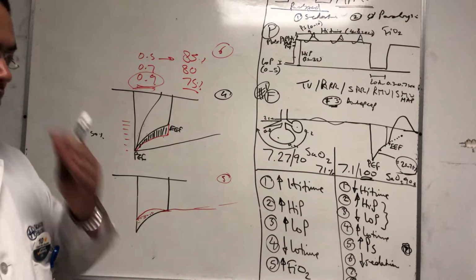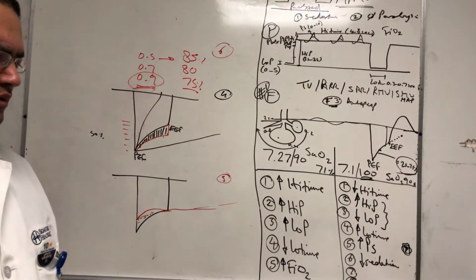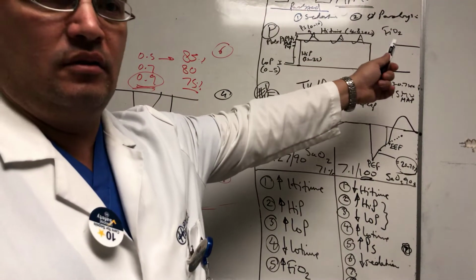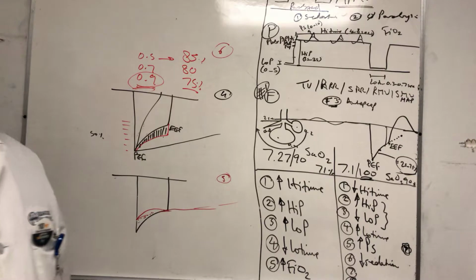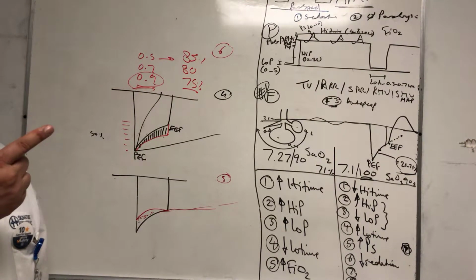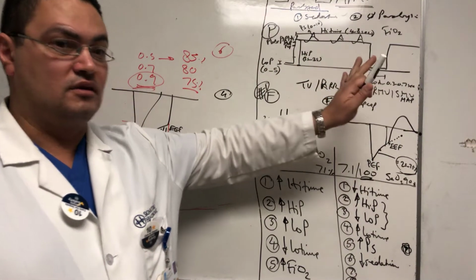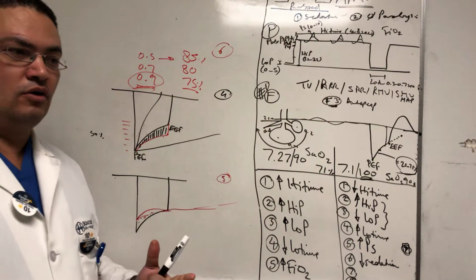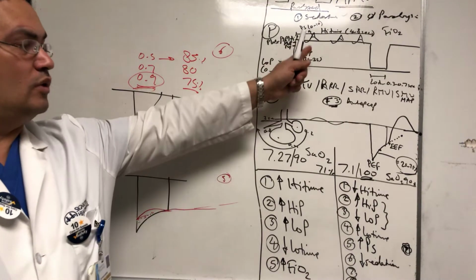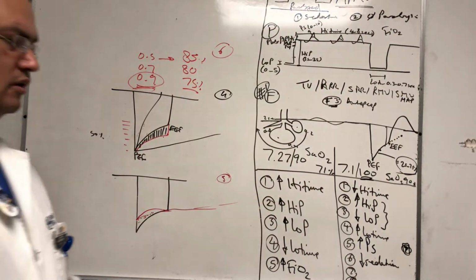Patient is doing worse, especially with acidosis. You decrease the sedation, which means you're going to increase the amount of breathing here. The rule of thumb is that you have to have at least one negative pressure breath on every cycle like this, right? So if you walk in the room and find those 6 seconds empty, there's something wrong. Either we're hyperventilating the patient or the patient is over-sedated. So you tell the nurse, please, we need to titrate at least one breath here. And of course you can increase it more and more by decreasing sedation.